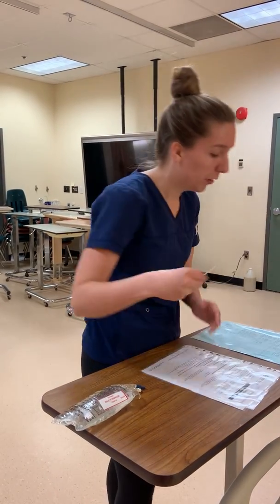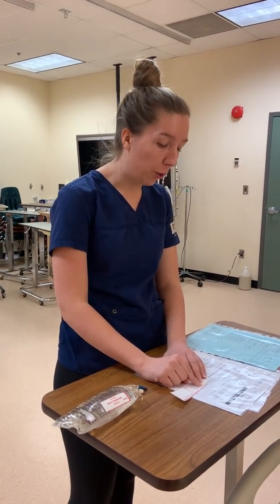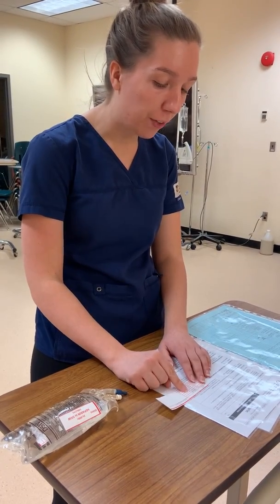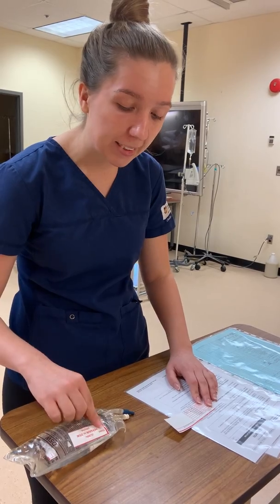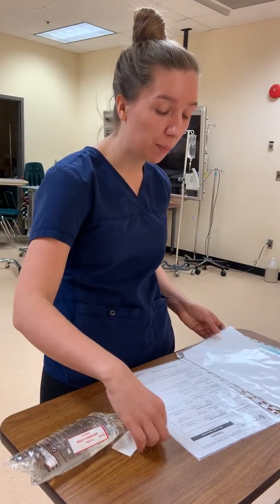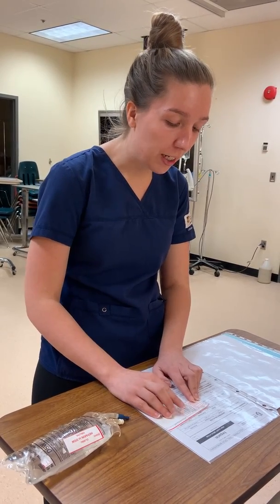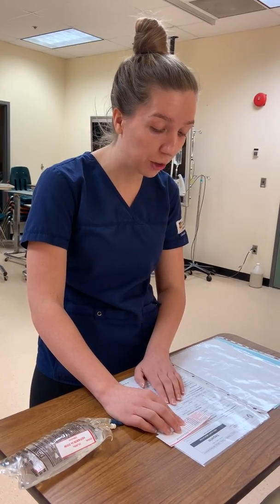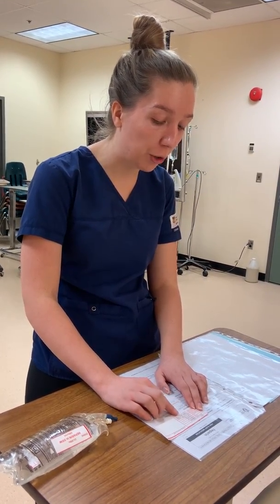At this point, I can now fill out a label for my patient, which I've had the opportunity to do. So I put the name, Wendy Holmes, the drug name, which is heparin, the dose, which is 25,000 units in the bag with the volume and diluent of 250 mLs as indicated on the bag, but also on the monograph. I also confirm the concentration, which is 100 units per mL, which you can do by also doing 25,000 units divided by 250 mL. The date and time, March 13, 1430, and my signature, MB UMSM3.